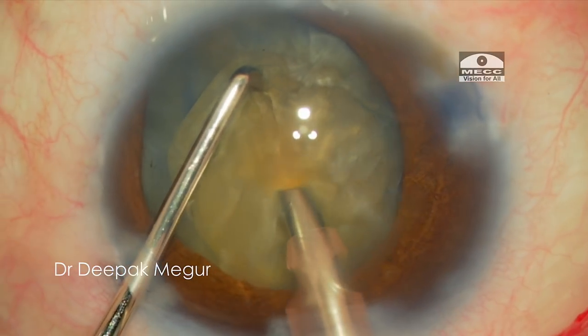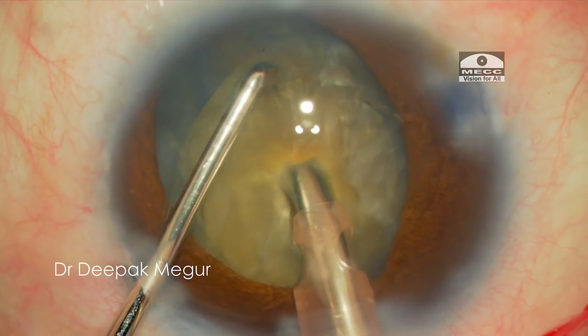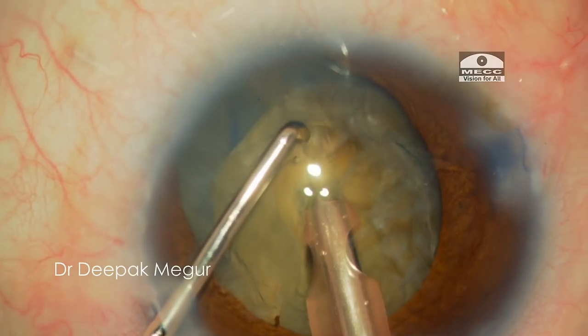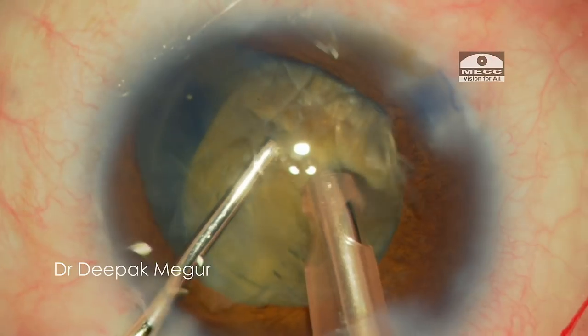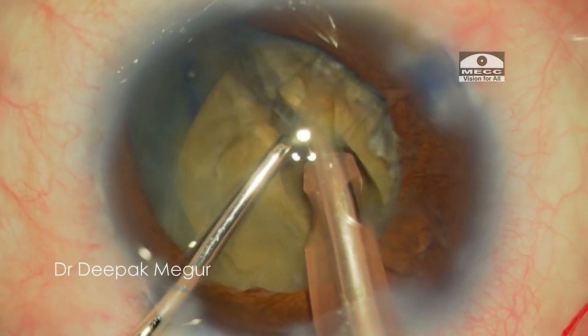Moving on to phacoemulsification of the nucleus. I am making an initial small groove so that I can bury my phaco tip deep into the nucleus substance to get a firm grip. This would help me achieve a successful chop in this dense nucleus.